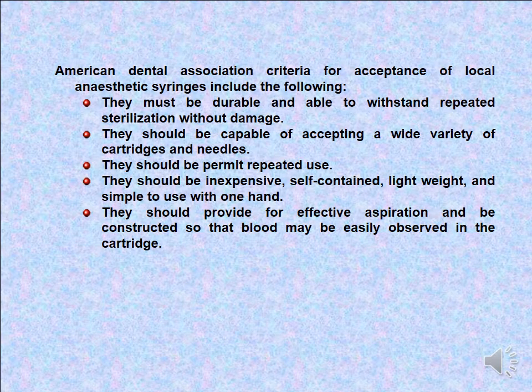The American Dental Association criteria for acceptance of a local anesthetic syringe include the following. They must be durable and able to withstand repeated sterilization without damage. They should be capable of accepting a wide variety of cartridges and needles. They should permit repeated use. They should be inexpensive, self-contained, lightweight, and simple to use with one hand.